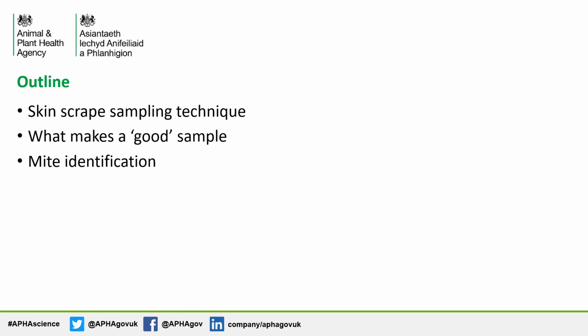In this presentation I will cover the sampling technique for taking skin scrapes, what constitutes a good sample, and identification of the sheep scab mite, Psoroptes ovis.